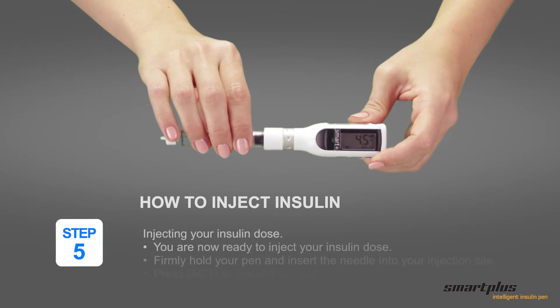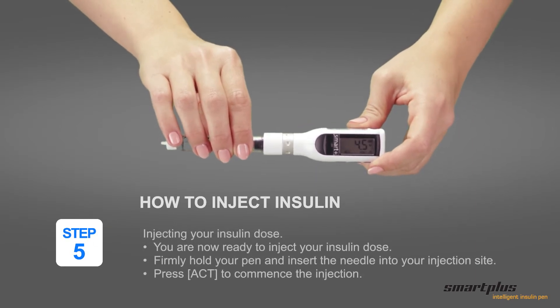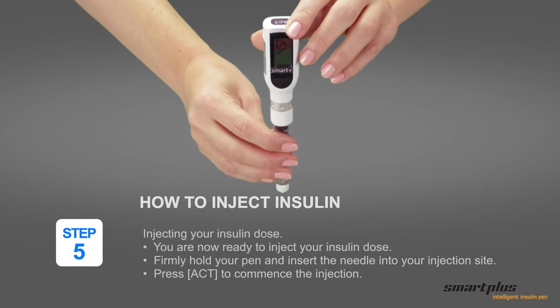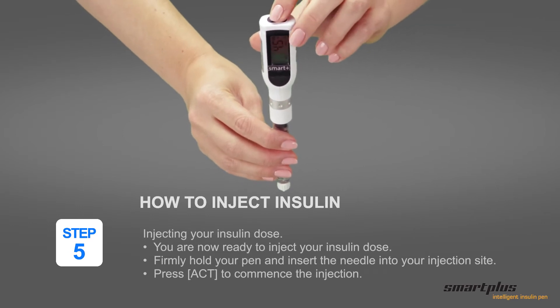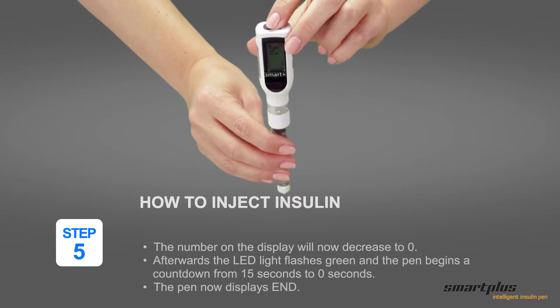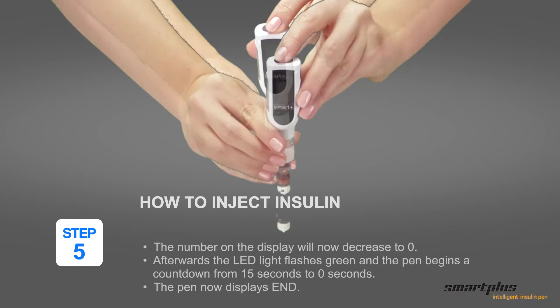Step 5: Injecting your insulin dose. You are now ready to inject your insulin dose. Firmly hold your pen and insert the needle into your injection site. Press ACT to commence the injection. The number on the display will now decrease to 0. Afterwards, the LED light flashes green and the pen begins a countdown from 15 to 0 seconds.